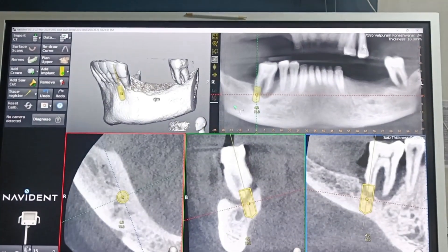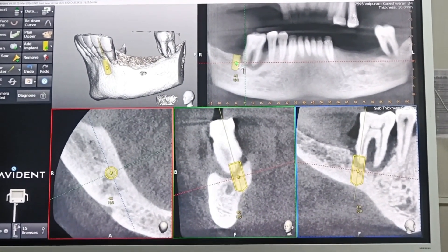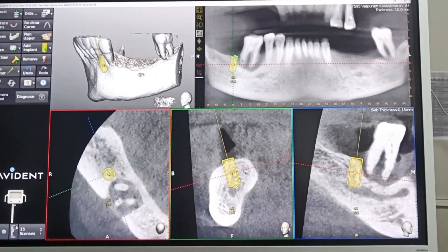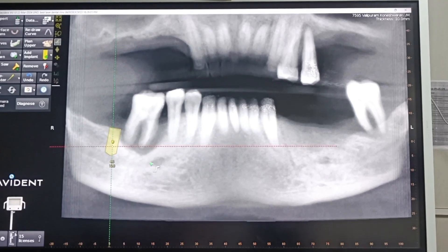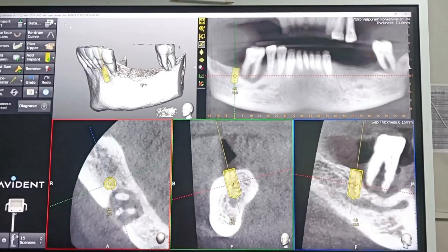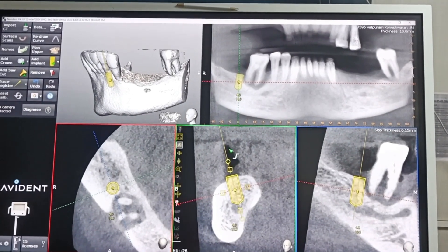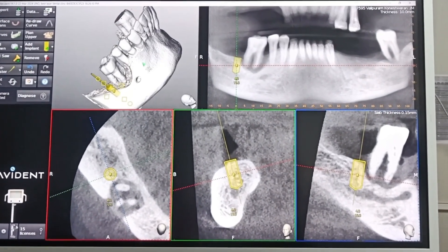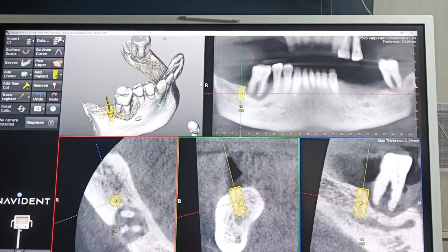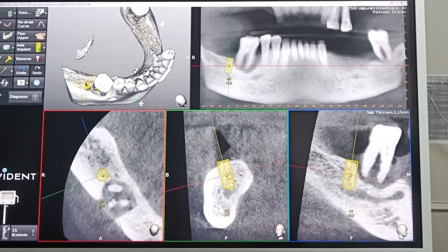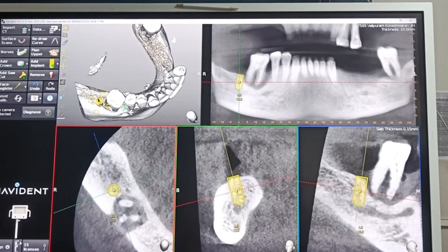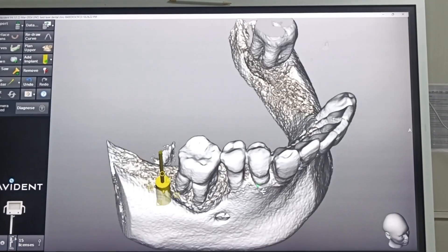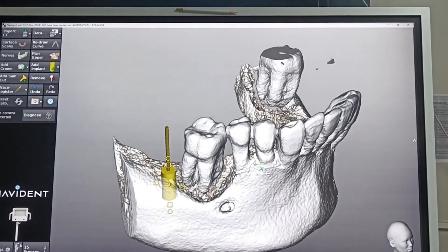Our plan is to place an implant distal to 6. This is the distal-to-6 defect area. There is a lot of granulation tissue close to the canal — there might be some feeder vessel from the canal directly into the 6. Actually, this may not be 6; it might be 7, as it may have migrated and rotated.